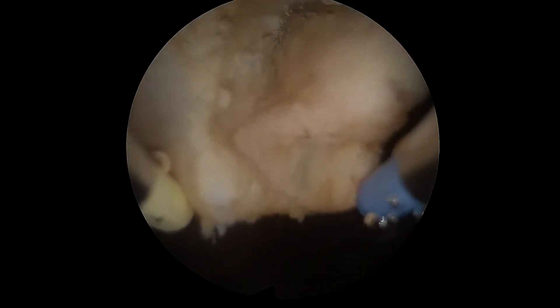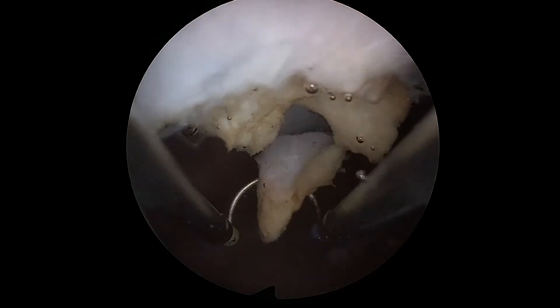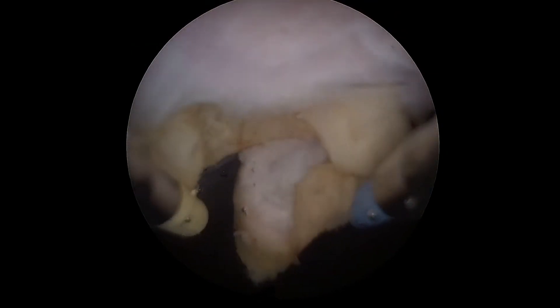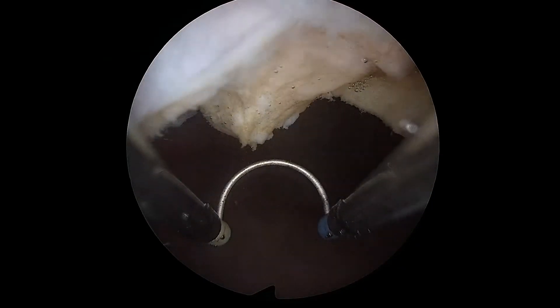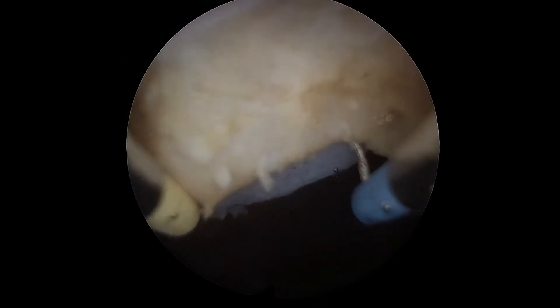In this model, note the demonstration of the far-to-near resecting direction, a technique that best prevents perforation.